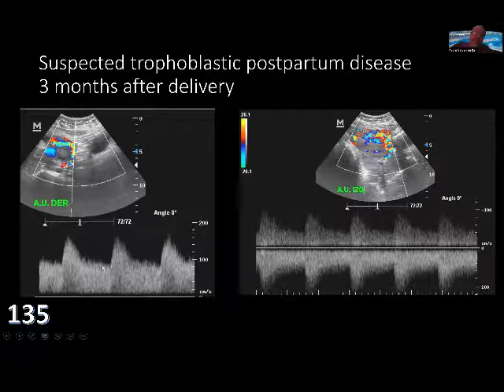This is a low resistance right uterine artery. This uterus thinks that it is still pregnant. This would be perfect if seen during pregnancy. This would mean this lady will never develop high blood pressure associated with pregnancy. This is a low resistance uterine artery. The left uterine artery is even lower resistance and really highly vascularized on the left side of the uterus.